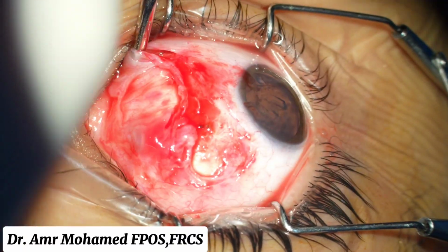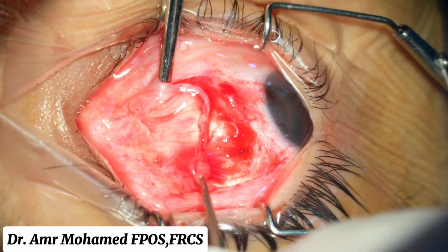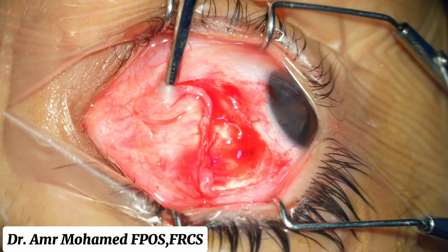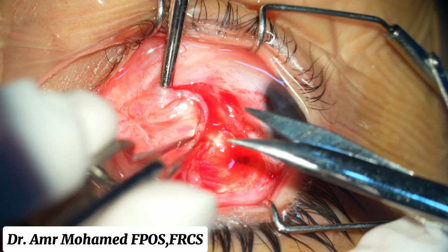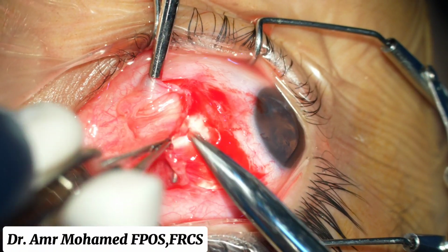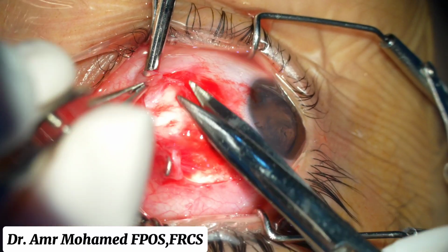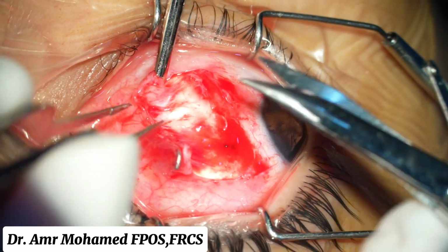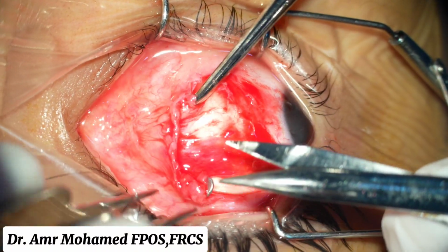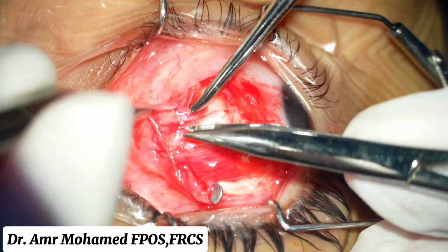In such cases, usually the muscle will be more posterior from the limbus, and you might need to insert the hook far more posteriorly to reach the muscle. And during hooking the muscle and isolating the muscle, you need to be gentle, because sometimes there will be stretched scar or pseudotendon, and the muscle will be fragile, and the risk of losing the muscle might be higher.